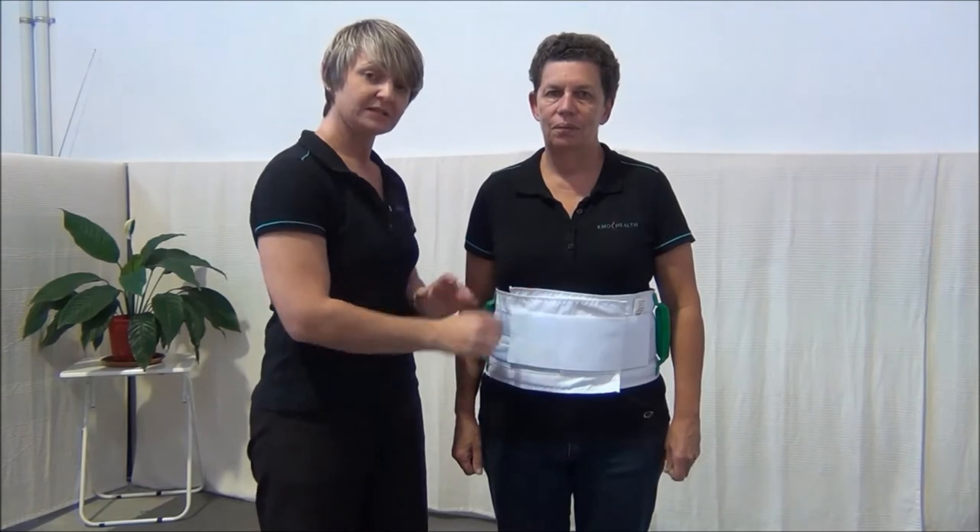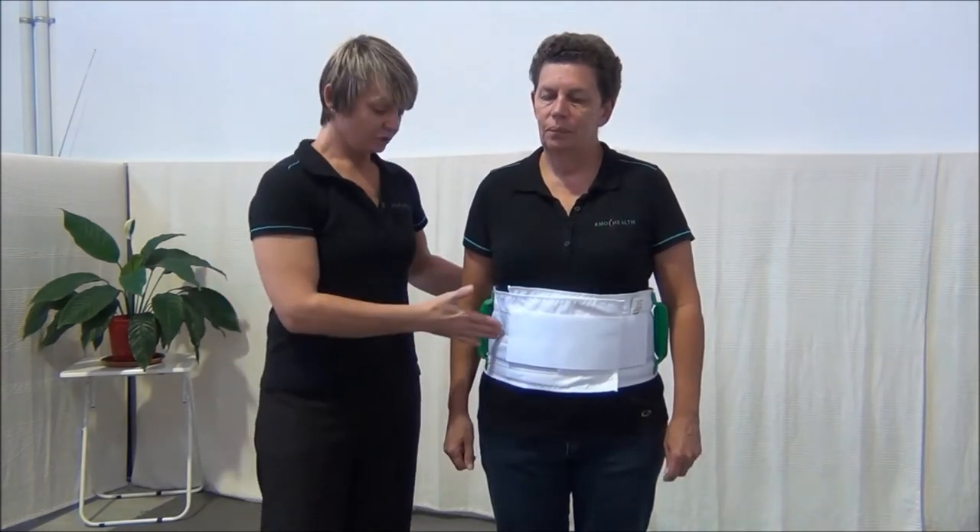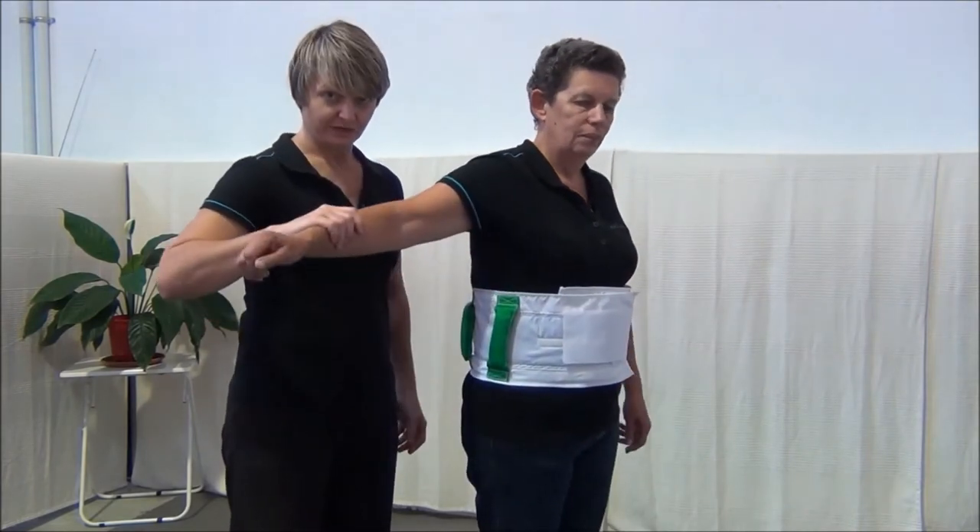How to hold a walk belt. A walk belt is here just for the staff to help to guide and stabilise the client only. When using a walk belt, you'll notice that there is a handle at the front and at the rear.